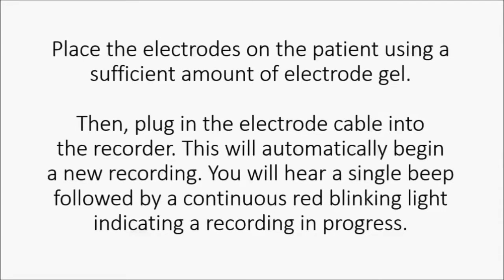Place the electrodes on the patient using a sufficient amount of electrode gel. Then plug the electrode cable into the recorder. This will automatically begin a new recording. You will hear a single beep followed by a continuous red blinking light, which indicates a recording is in progress.